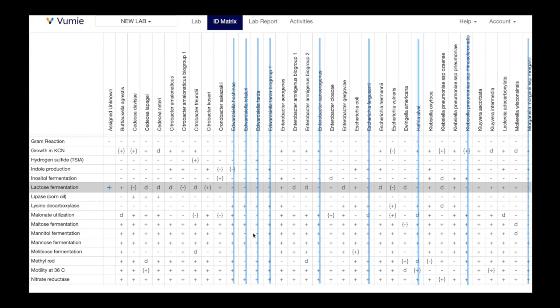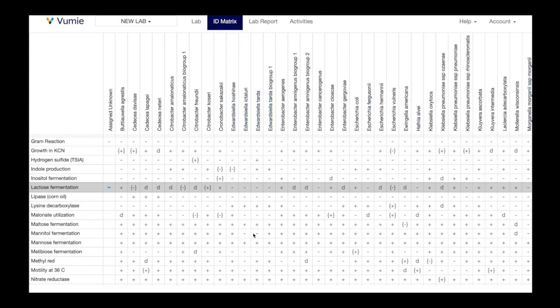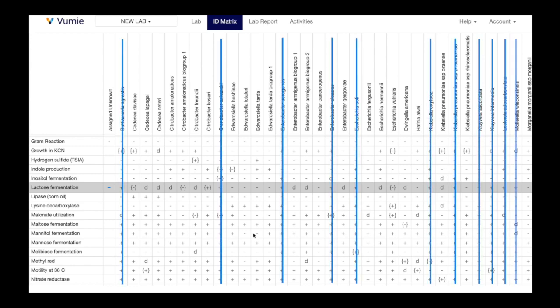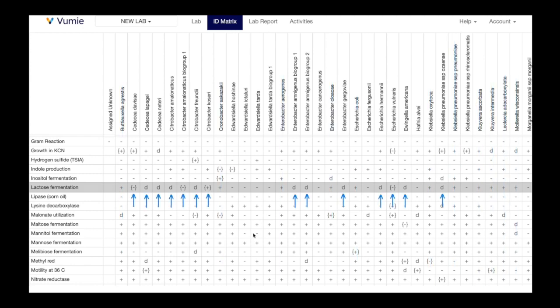Enter a negative for that test, and all positives for that test are eliminated. What about results that are not a clear negative or positive? They remain in the matrix until eliminated by another test where positive and negative results are found.